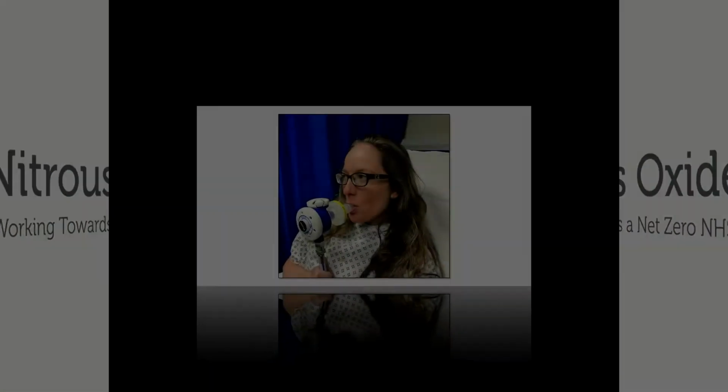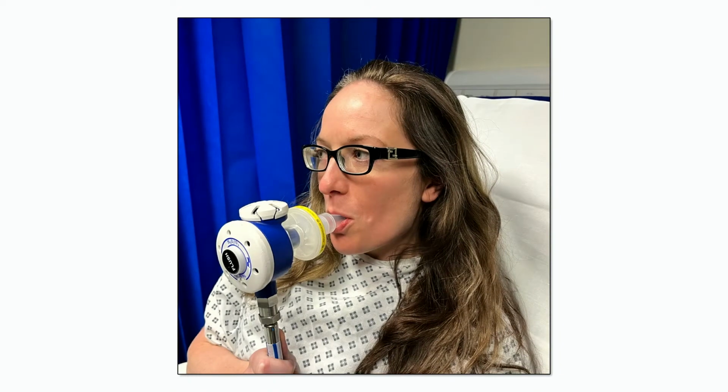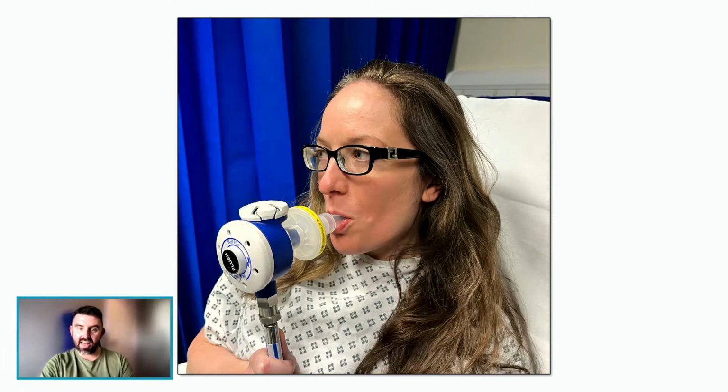of our work. So what you're going to see on the first slide is actually a colleague of mine posing with a demand valve, the thing that most women in labour will use to get nitrous oxide or gas and air. And if we just show the little arrows, when she takes a breath in comes a lungful of nitrous oxide and oxygen mixed, and when she takes a breath out with the next arrow, it's expired through that valve into the room. So every breath ends up going straight out into the atmosphere, but via the room that's got maybe the birth partner and the midwives and so on.